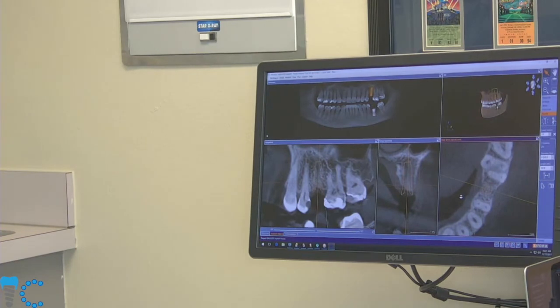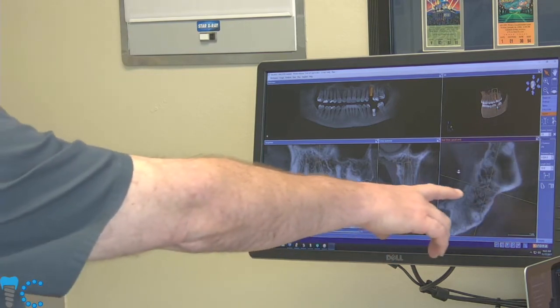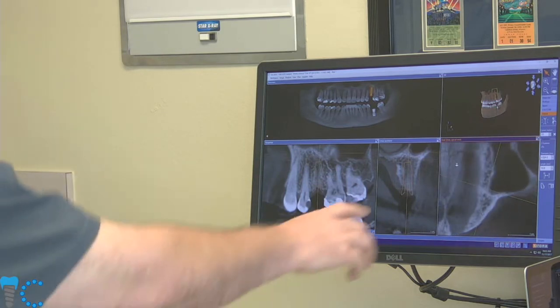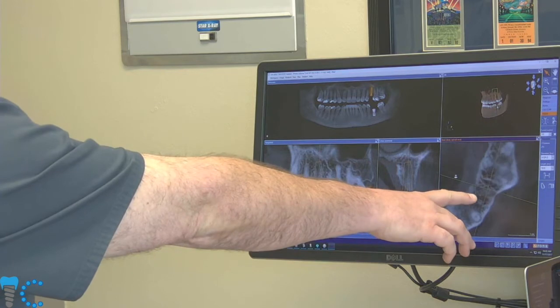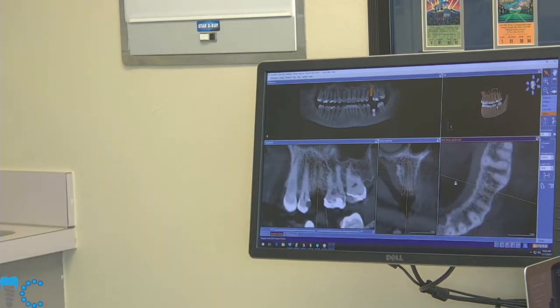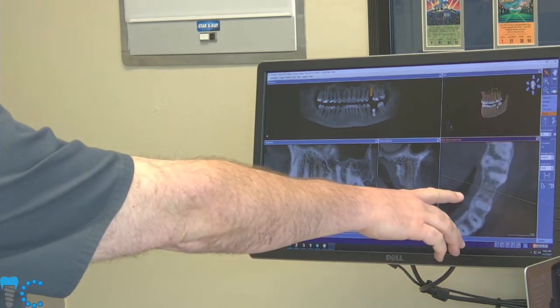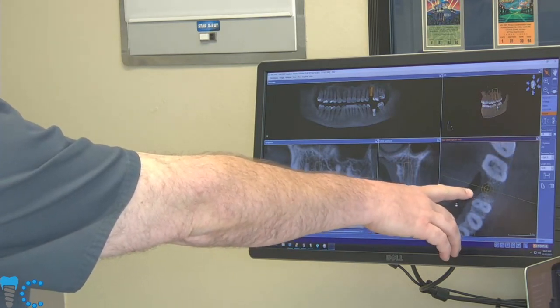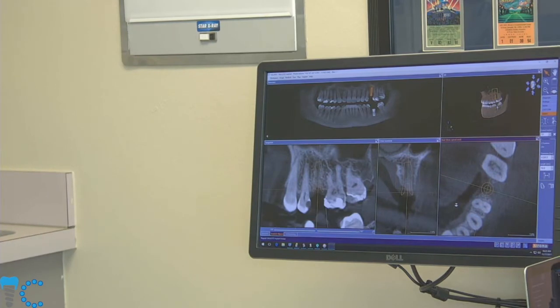And as we go down, we see that the ridge pretty quickly expands in width and becomes really a pretty ideal ridge form for our implant. So we literally see the threads rotating around, and then we see our safety zone below the sinus. So coming back, here's the apex of our implant right there, and we're riding up the implant till our ridge narrows off, and then we see the implant get wider at the shoulder, taper out to a 4.8 millimeter, and we still have plenty of space between our adjacent teeth.